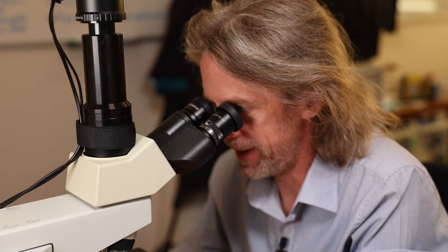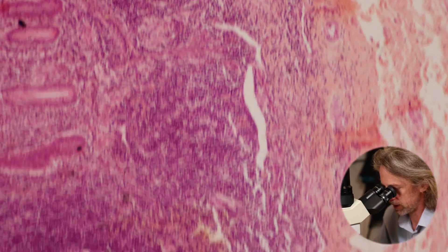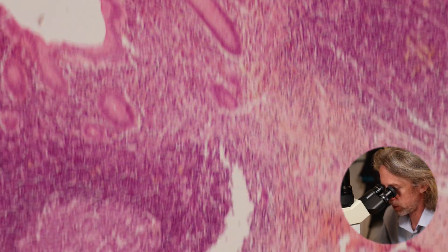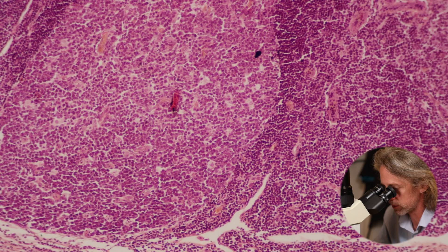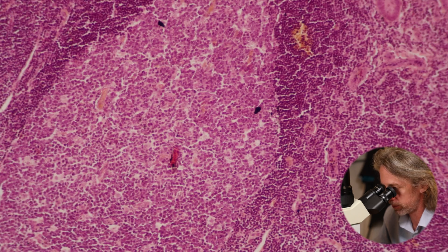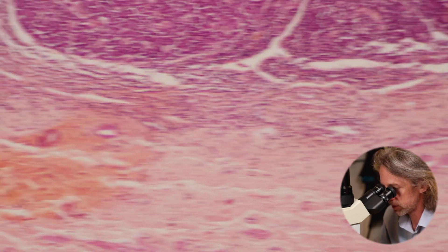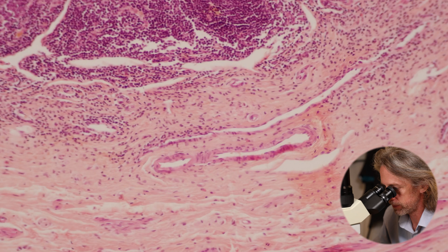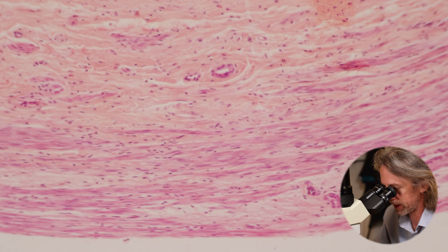Do you see what I mean about what you expect to see versus what you actually see? Elsewhere in the gut we've seen a muscularis mucosa — a thin layer of smooth muscle marking the border between mucosa and submucosa — but we're not seeing that here. So here's the submucosa. What we can see in the submucosa is small blood vessels — arterioles, venules, lymphatics — and there'll be nerves in there as well.